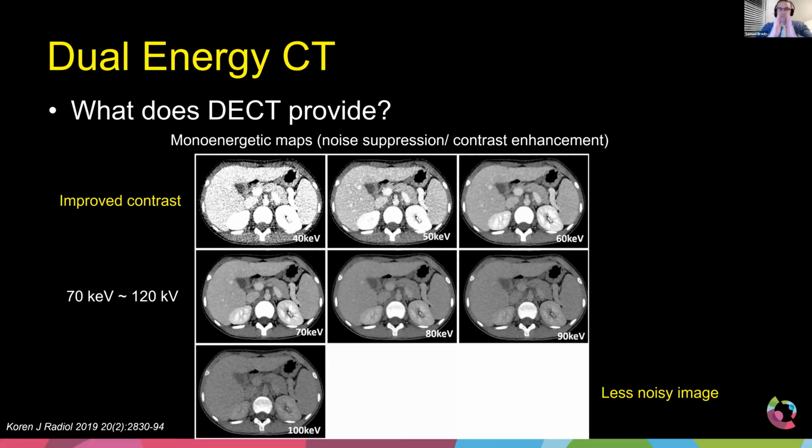So a true monochromatic image would look like each one of these images, but we don't do that. There is such a thing as synchrotron radiation, and we can image with that, but that's just not what we do in the clinic. It's academic. We don't even think about that. The closest thing we can get to monochromatic imaging is breast imaging, and that's just because we have really low energy with the different filters.